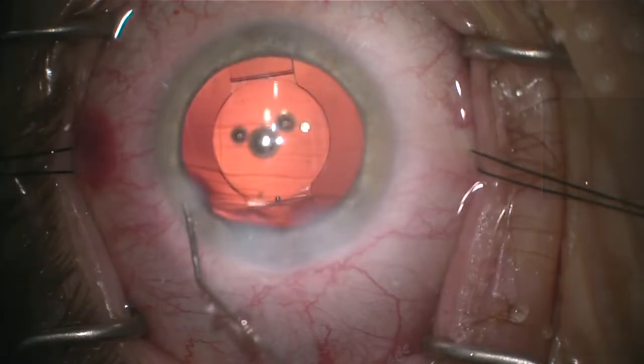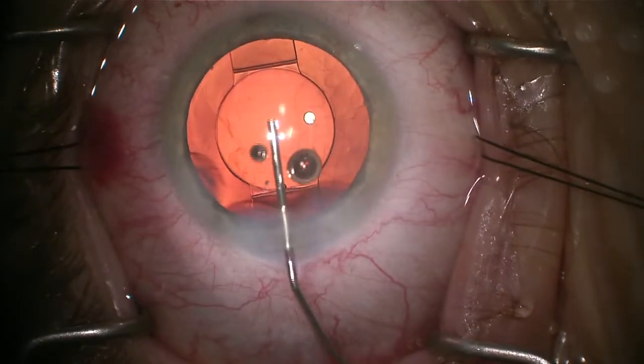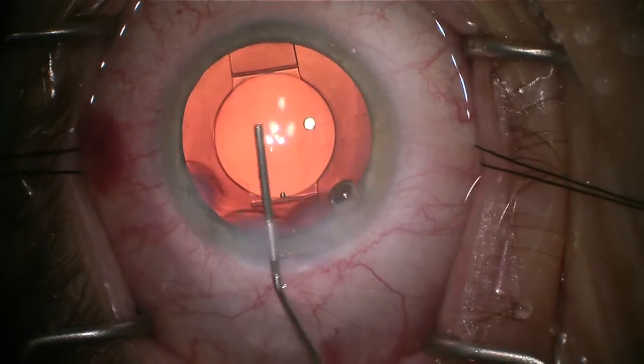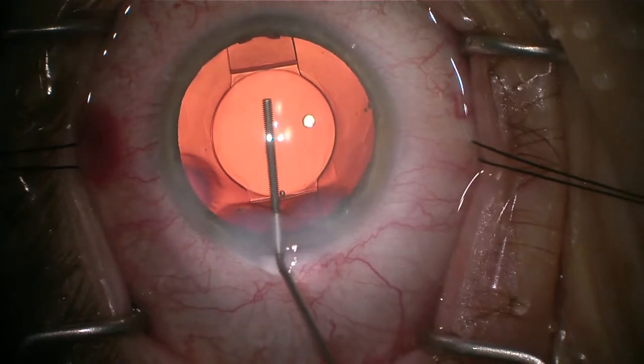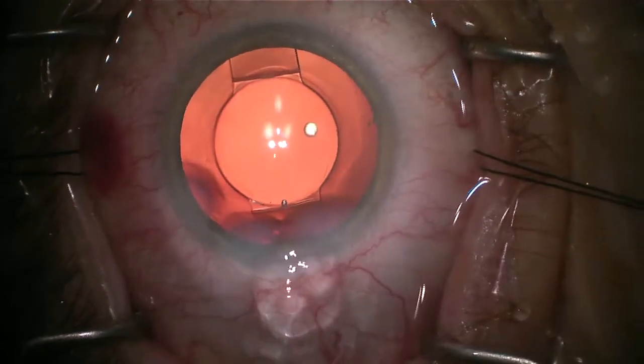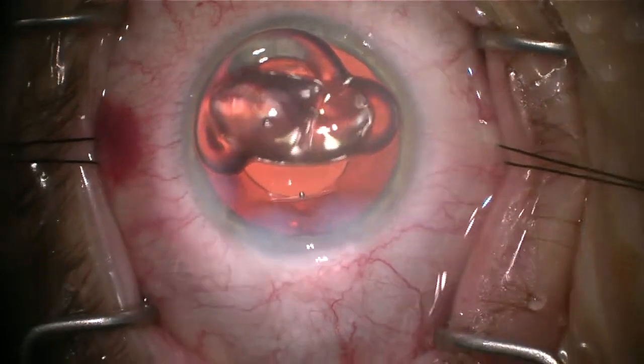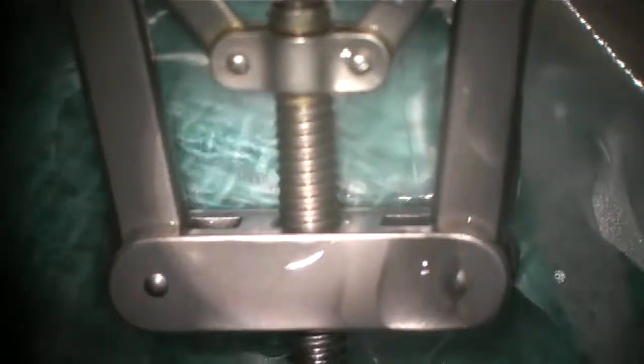Here we are after implanting the IOL, hydrating the paracentesis, and then injecting a cohesive viscoelastic to give ourselves enough space to operate and view with the gonia prism. Putting viscoelastic on the cornea, I like to rotate the head about 25 degrees or so, and the scope as well 25 to 30 degrees, to give ourselves a nice view of the entire angle with the gonia prism.